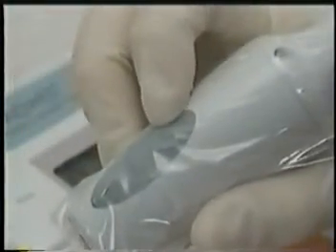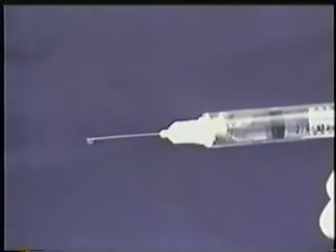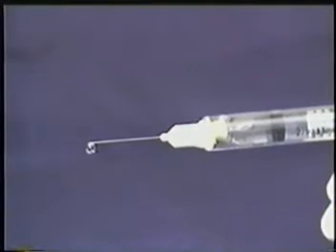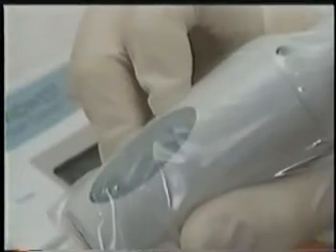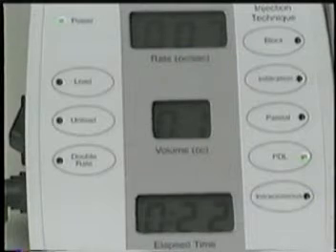If you want to increase the rate of the injection, you can do so at any time after the first 10 seconds of the injection. By pressing the double rate button, the increased rate will be identified by 2 audible beeps. Press the double rate button again to revert to the normal rate. At any time during the injection, you can reference the rate, volume, and elapsed time for that injection.